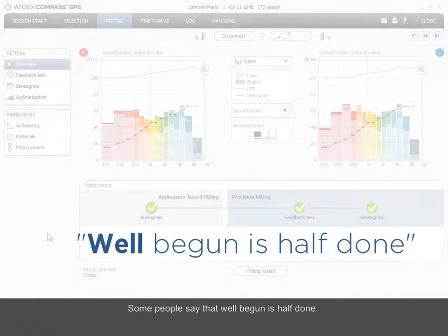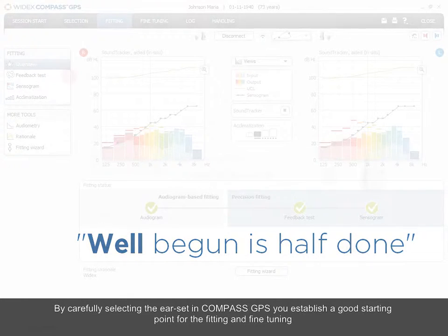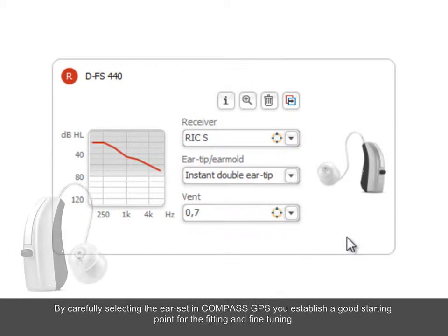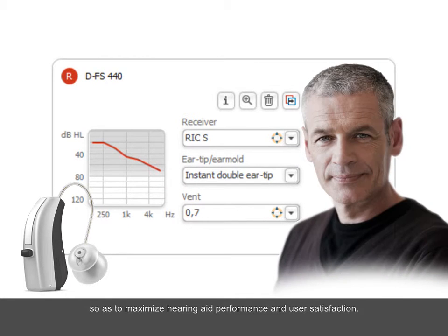Some people say that well begun is half done. By carefully selecting the ear set in Compass GPS, you establish a good starting point for the fitting and fine-tuning so as to maximize hearing aid performance and user satisfaction.